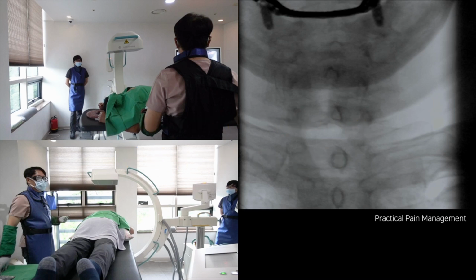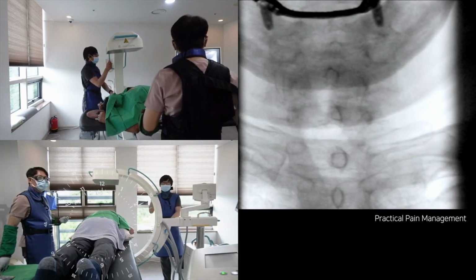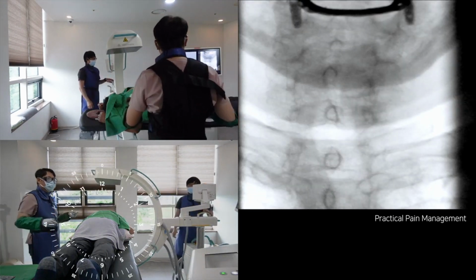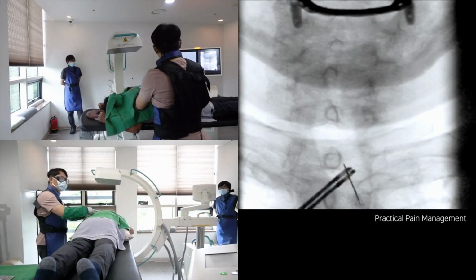contralateral oblique image. First, adjust the C-arm to target the cervical vertebra level on an AP view. During the AP view, ensure the C-arm is perpendicular to the spine, not the patient's body. You'll generally need a cranial tilting angulation of the C-arm, which can depend on the cervical posture, but typically requires a 3 to 5 degree cranial tilt for the C7T1 approach.